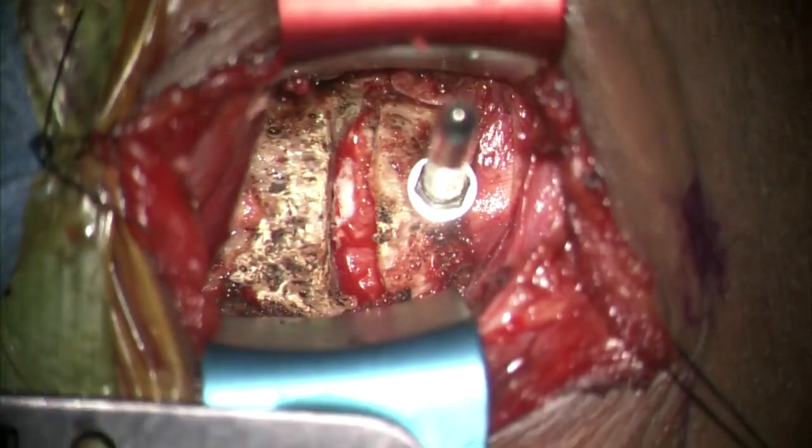Using the midline and the orientation of the end plates as reference points, Casper distractor pins are placed and the disc space is gently distracted.